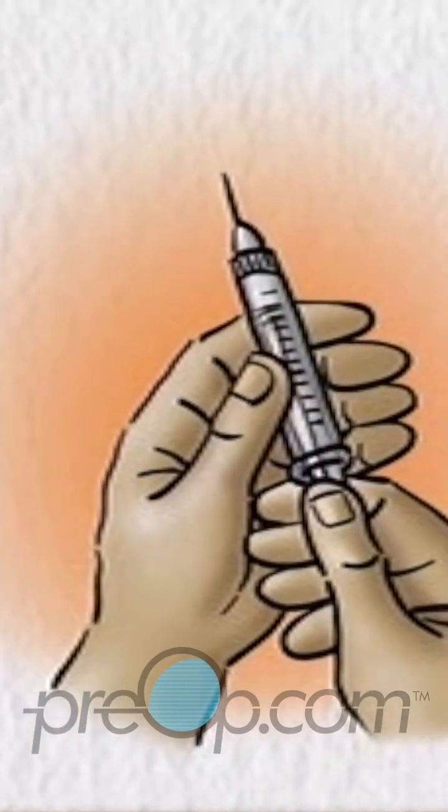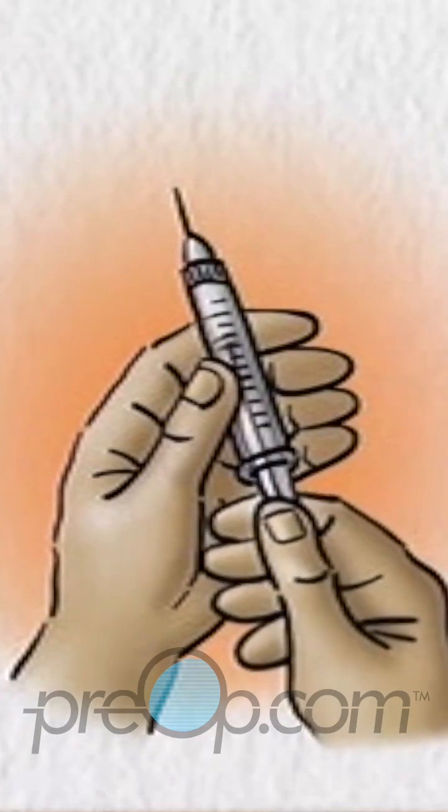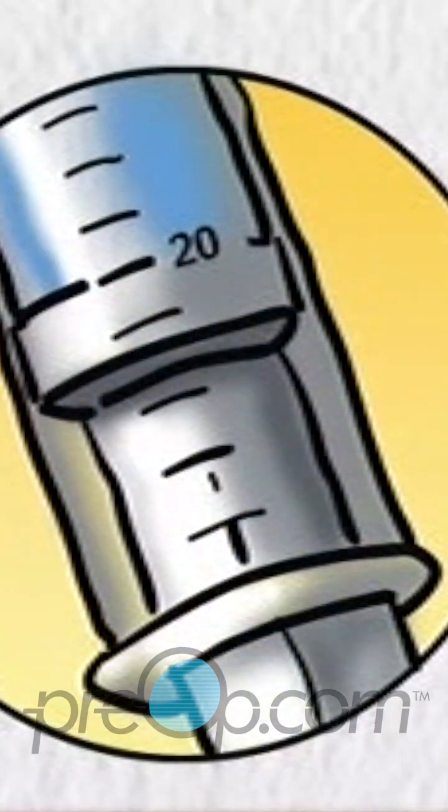Pick up the syringe and remove the needle cap. With the syringe held upright, pull the plunger back until the end of the plunger is at the mark of your dose, which in this example is 20 units. There is now air in the syringe.